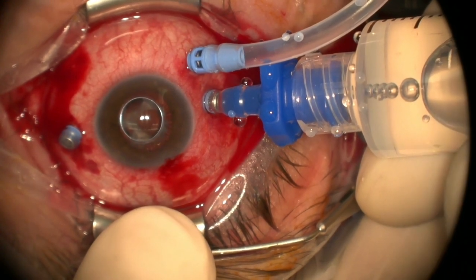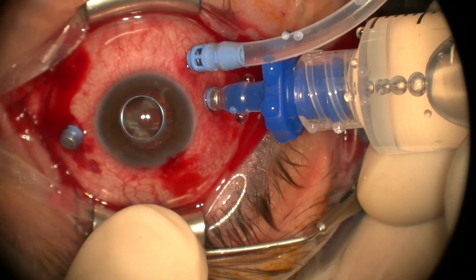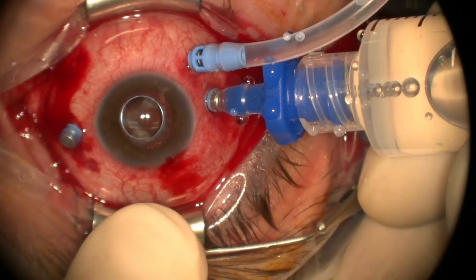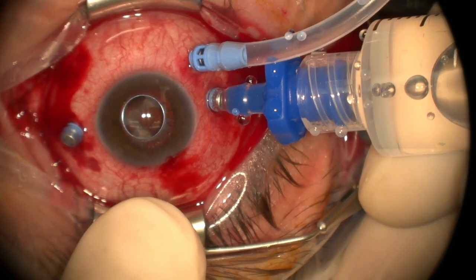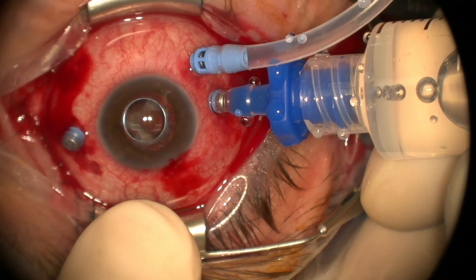I don't think his risk is that high. I think you can kind of judge that or modify that number when you're looking in the eye before surgery. You know, what kind of scar tissue are you seeing? Where are you seeing it? How do the edges of the retinectomy look? I think he had a rather large inferior retinectomy already. So we'll look at all that when we're doing our membrane peel.